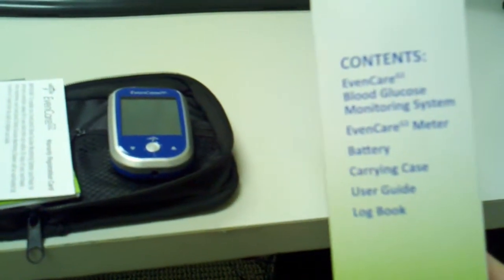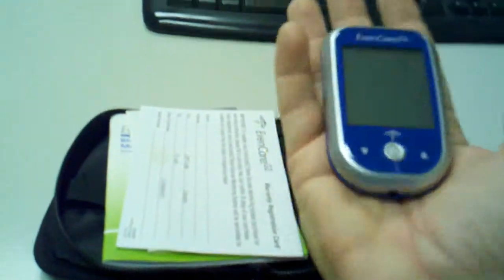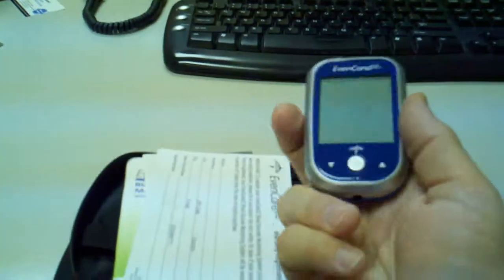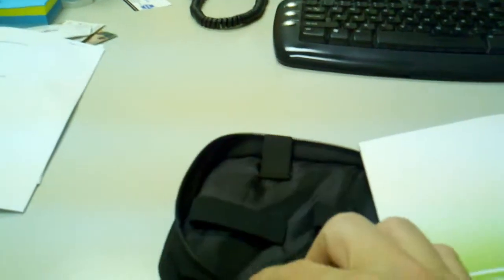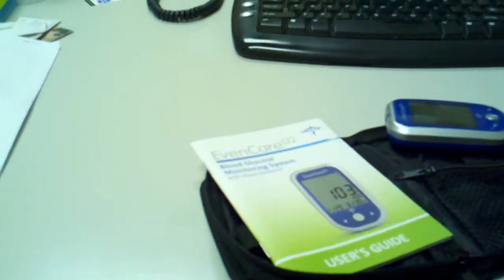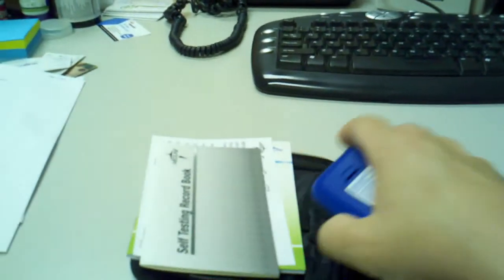The contents of this unit — you can see here — includes a battery, meter, carrying case, user guide, and log book, along with the system itself. One thing I've noticed in all the years we've been providing diabetic supplies: this device is about the size of my two fingers, which is actually pretty small — probably the smallest I've seen in the industry. It comes with a nice little carrying case as part of the kit, the user guide, the record book, and warranty information.